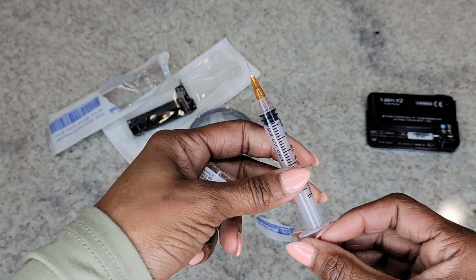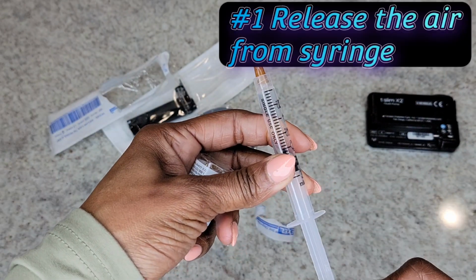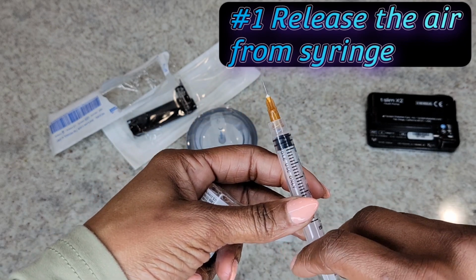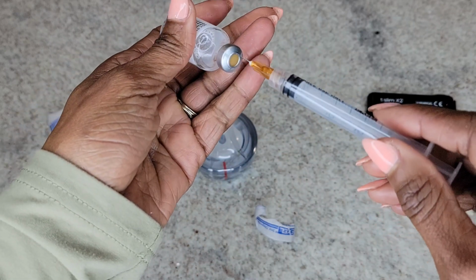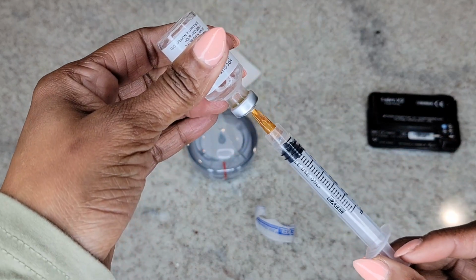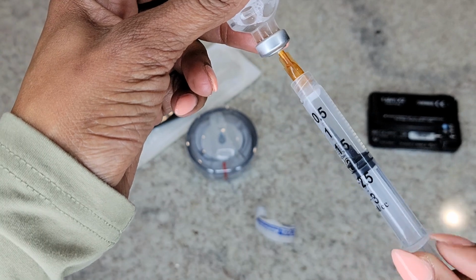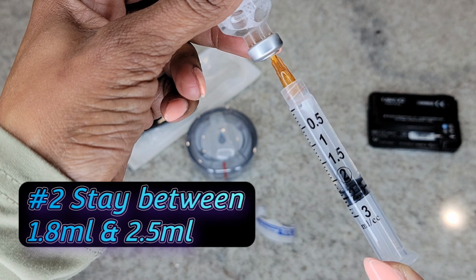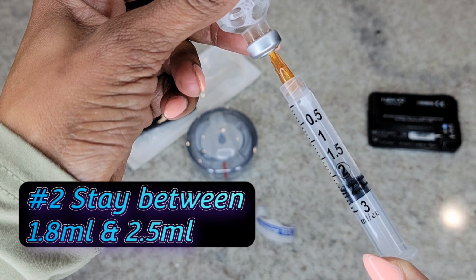The first important thing that is a must is pulling this syringe all the way back and then releasing any excess air. This is important because it helps to reduce the air bubbles that actually form when you're getting the insulin out of the bottle. I'm not going to fill it all the way up. This is the second important thing. I'm gonna stop it right there at 2.5.